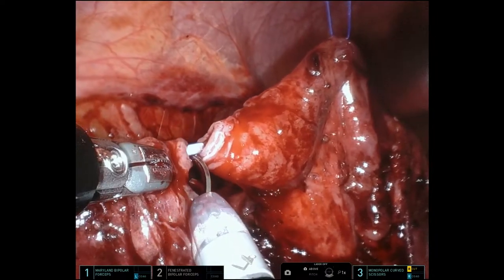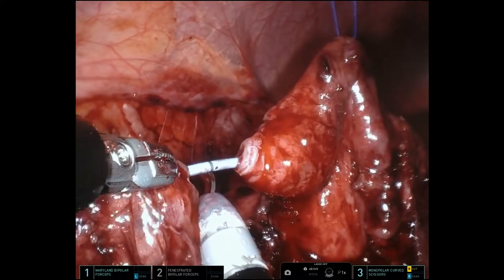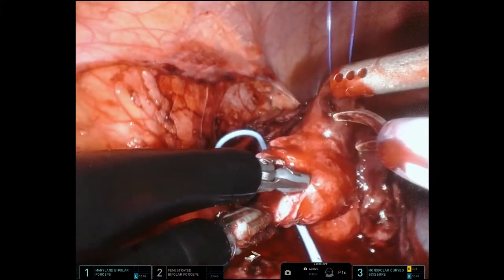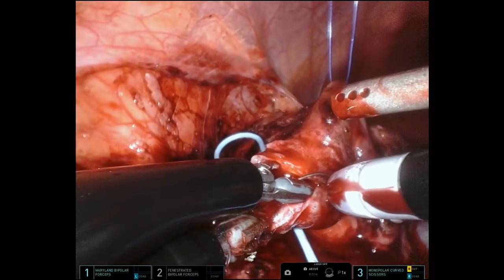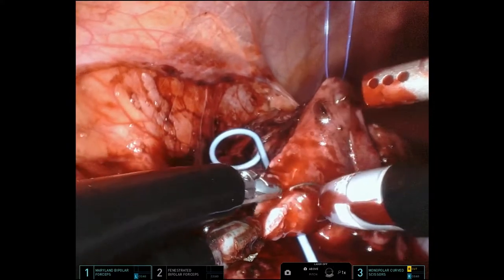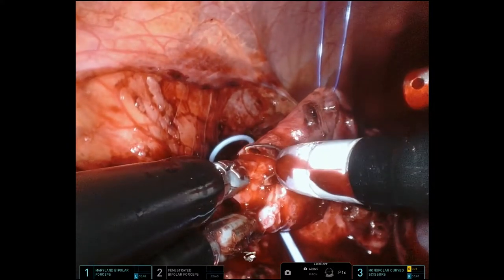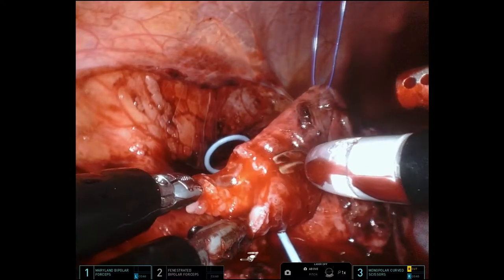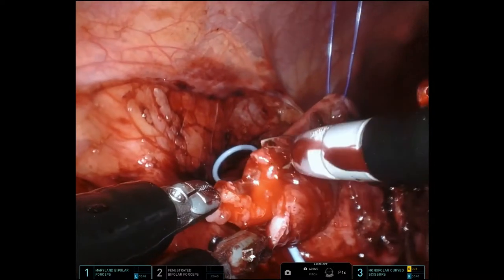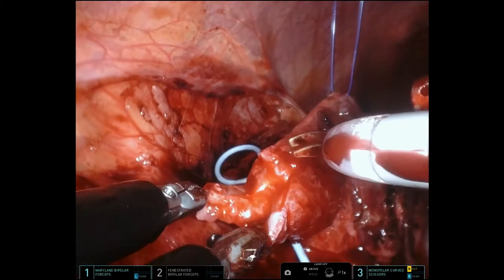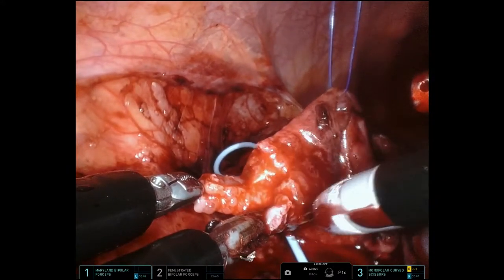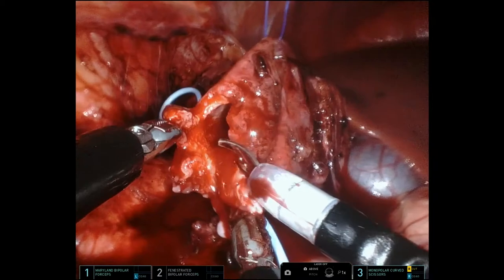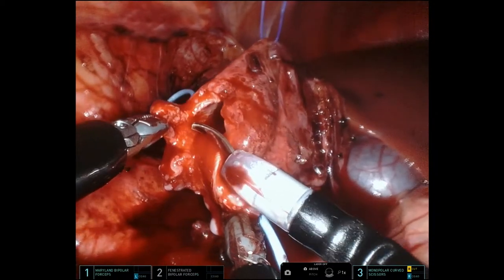There's the ureteral stent that had been previously placed, and you can see how narrow, tight, and stenotic that ureteral pelvic junction is. We cleaned off the renal pelvis and opened this to an area that was much more widely capacious and more suitable for an anastomosis. There's thick inflammatory rind around this tissue — that's why it looks so thick and why it's oozing more than typical.